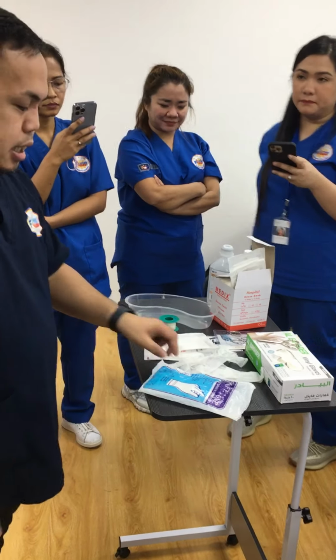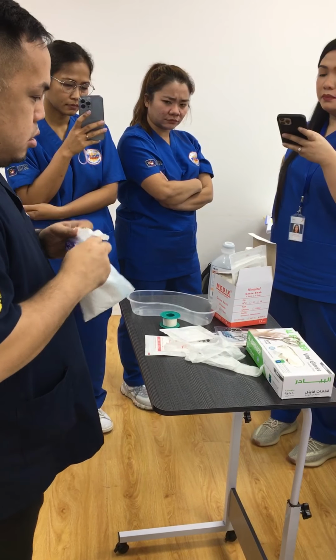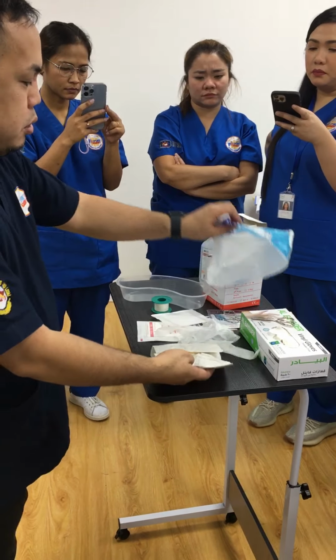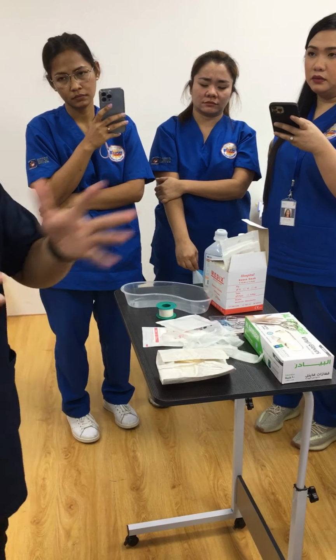Operation or something like that. But I will have to show you, because if you're about to assist or perform a surgical wound dressing, yung pagkatapos ng operation, right?